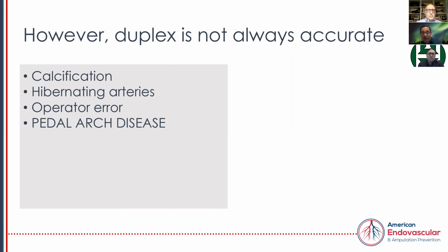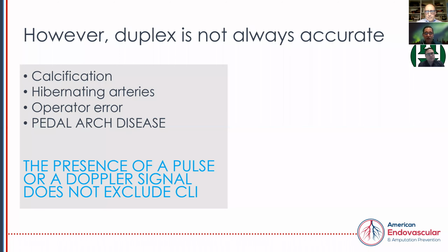Calcification, hibernating arteries, which refer to arteries which appear to be occult or occluded, but actually are patent. They just have very, very little flow in them. Operator difficulty. Pedal arch disease is very challenging because of tarsal containment within the bony structures.